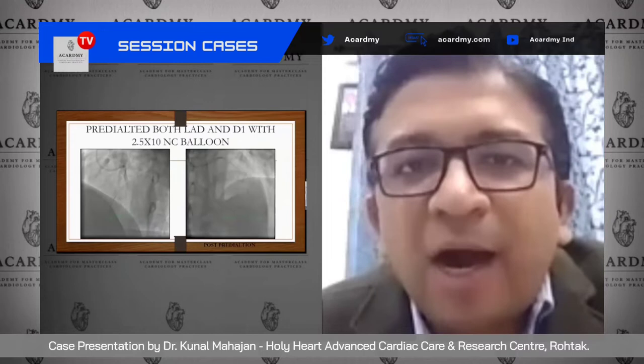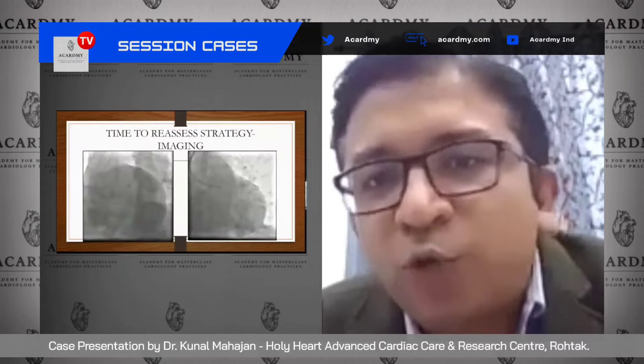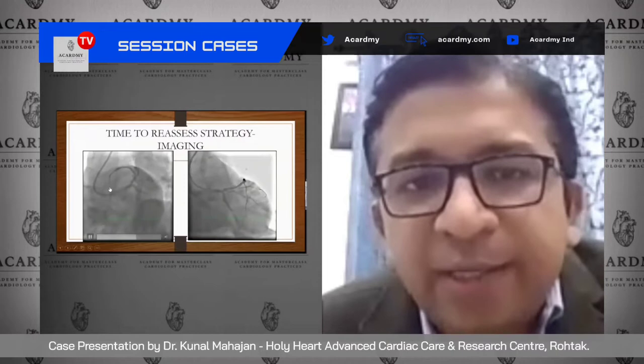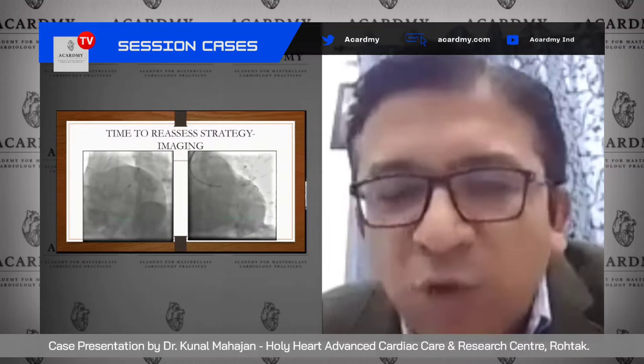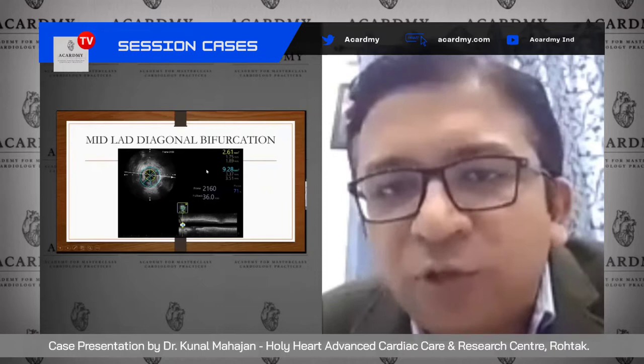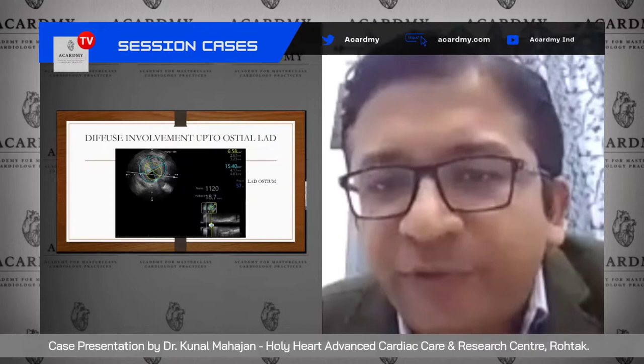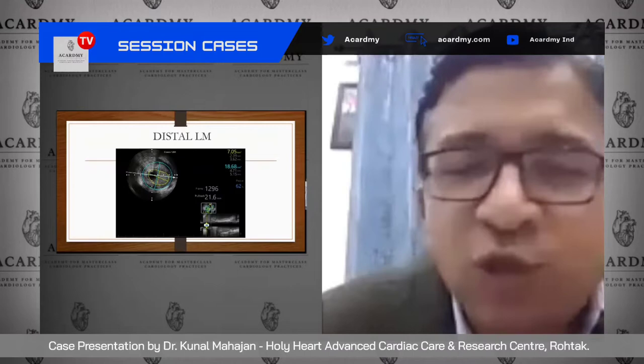We dilated both the LAD and diagonal with a 2.5×10 mm NC balloon. After these dilatations, the patient's chest pain improved and condition stabilized. Now was the time to decide our strategy, and that could only be done with imaging. On IVUS, the mid-LAD lesion showed the MLA was too tight despite dilatation, with diffuse disease up to the ostium. Plaque burden at the ostium was almost 57%, with an area of around 6.5 mm². The left main was also significantly diseased with a plaque burden of 62%, not angiographically apparent.